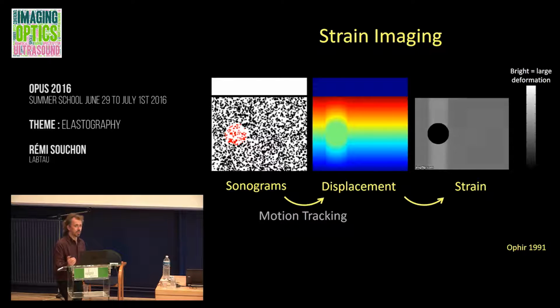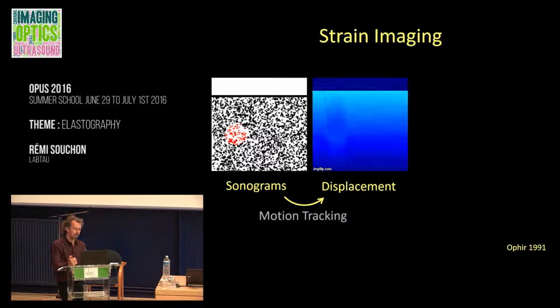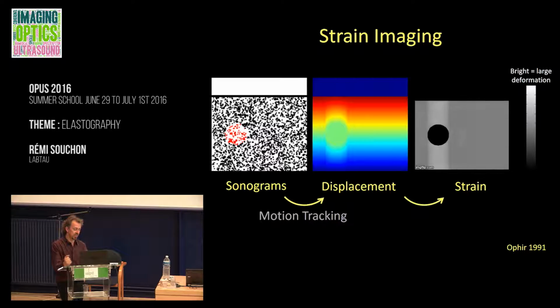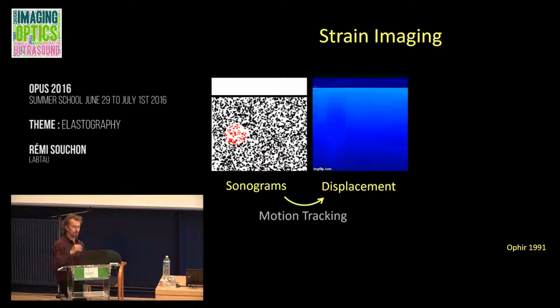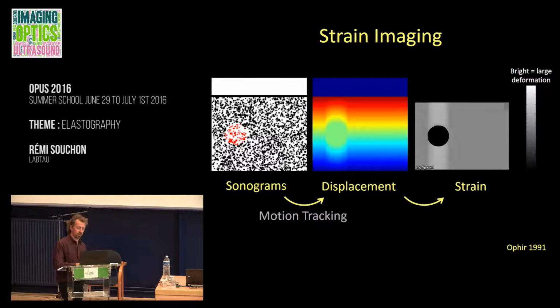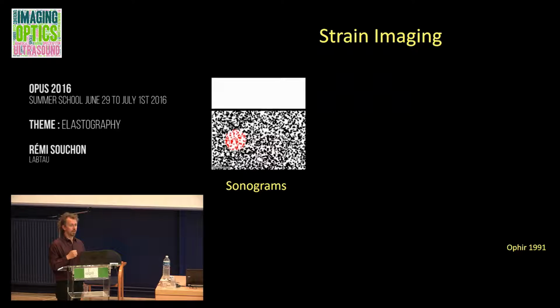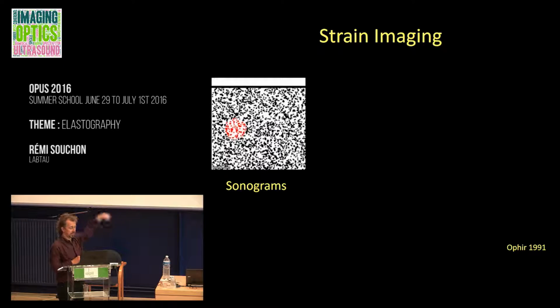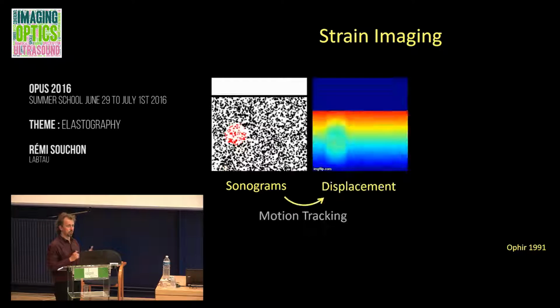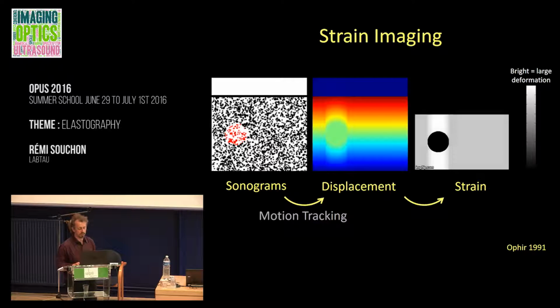It's not softer. So what's happening here, it's again one of the pitfalls of strain imaging. Remember that strain is not elasticity. And what happens is, because we have this very stiff ball here, it's not going to deform much. So all the surrounding soft media has to undergo quite a harder deformation because it's squeezed between the top rigid plate and this hard ball that doesn't want to compress either. And so this is why we get this strain concentration.